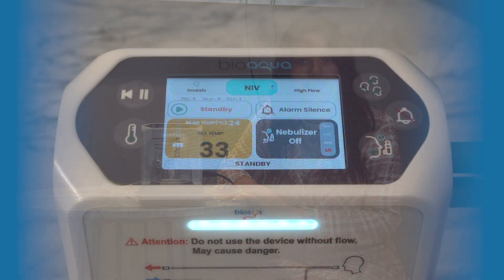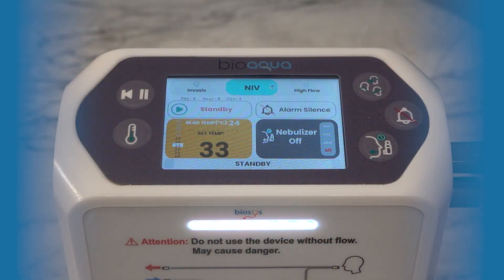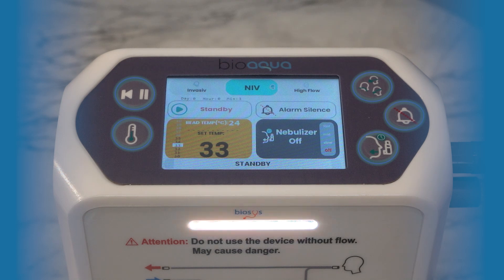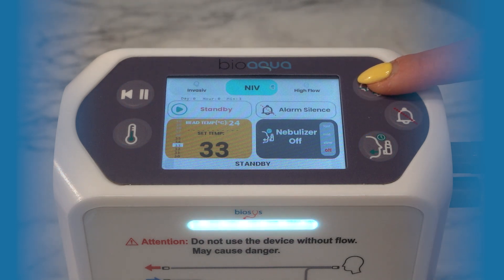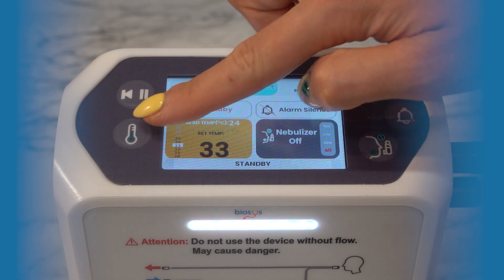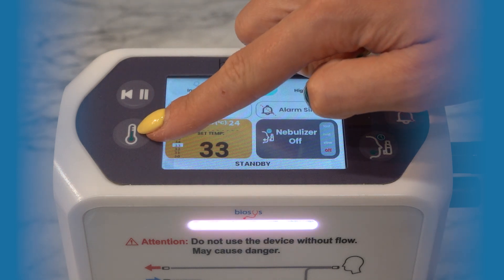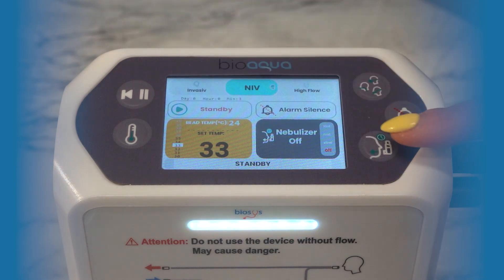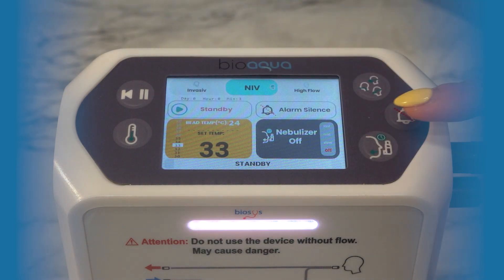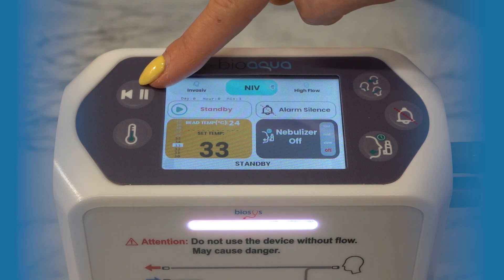Let's take a closer look at the screen. The device has five separate control buttons on its surface: mode setting button, temperature setting button, nebulizer setting button, alarm mute button, and start-stop button.